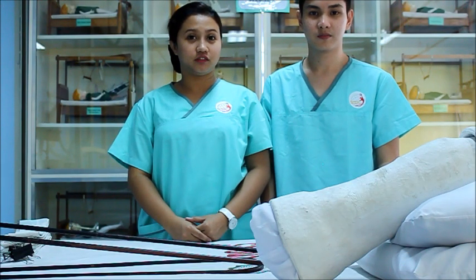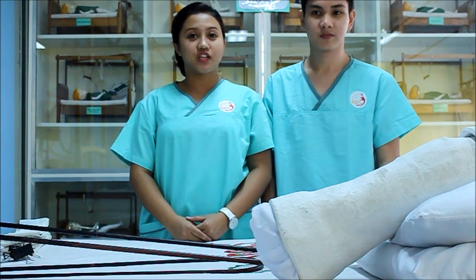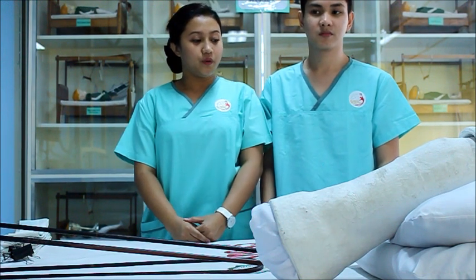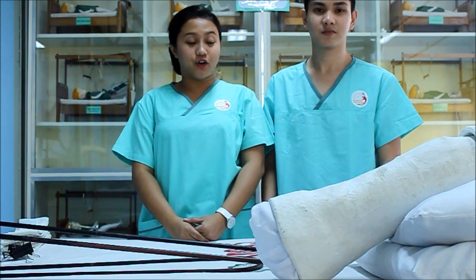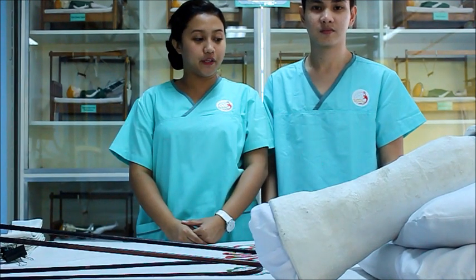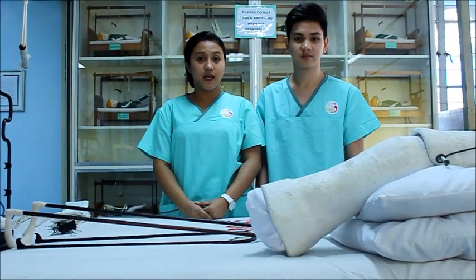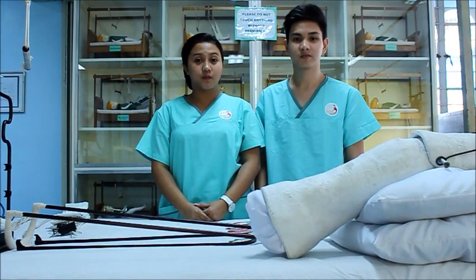Before we proceed, let's go to preparation. First, check the doctor's order. When checking the doctor's order, make sure to clarify the patient's name, check the extremity to be applied for balanced skeletal traction, and also check the weights to be applied.